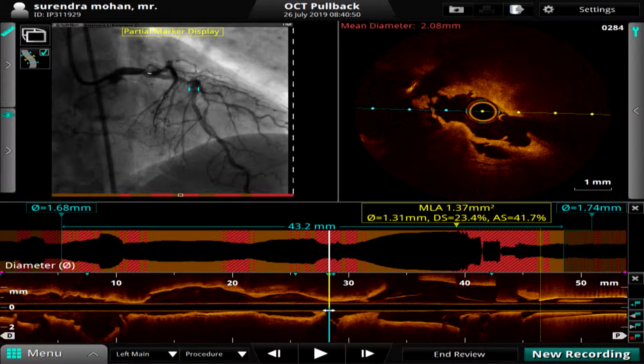Yeah, that makes sense. Because the patient was having angina and all these things, I didn't want to do it again and again. I agree so much. But that's one of the reasons why, honestly, if he's unstable or having angina and he's sick, some might just recommend stenting across, and then if you have to do provisional with the T and protrusion, that would be a very reasonable strategy.